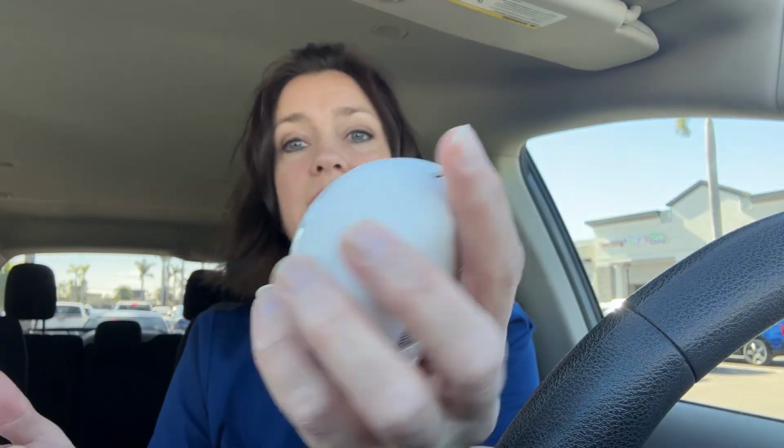So 1, 2, 3, 19, 20. It said 20 to 25 in the instructions. And you pull the cap off from behind and you put it over the part that went in the urine, and it's already running through. You can see that. And this is charged up and ready to go. You'll see that my PDG from last time was 17 on January 20th. Probably the highest PDG I've ever seen on the Mira without taking a supplement.